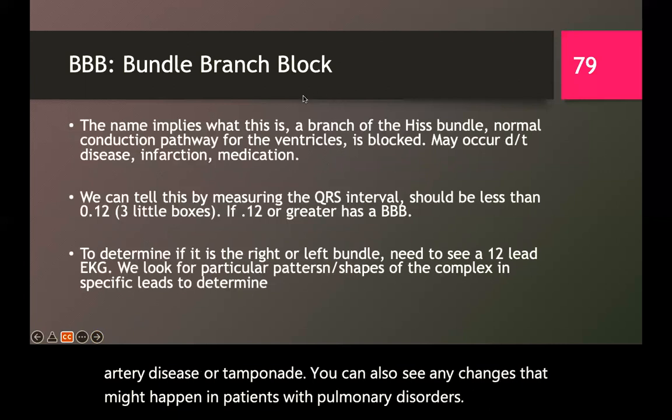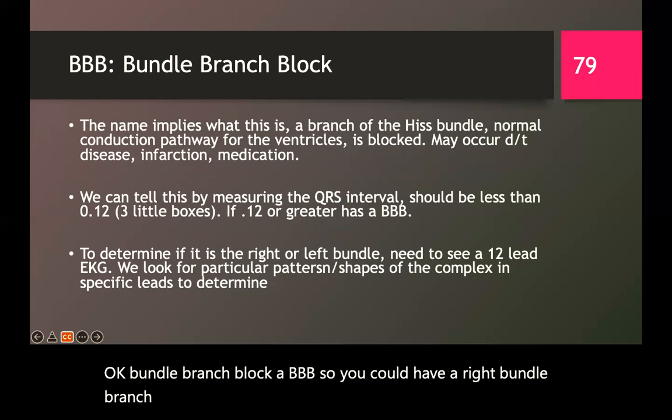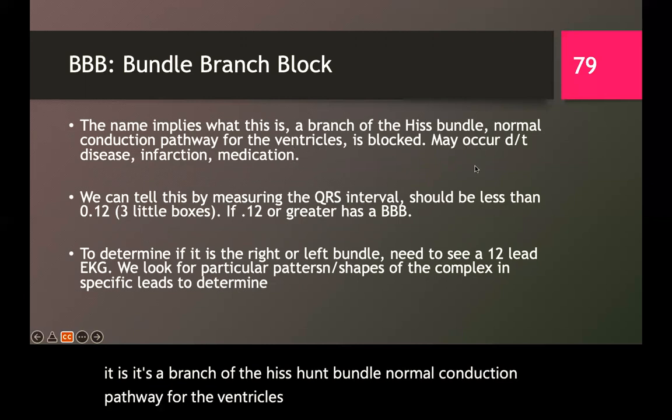Okay, bundle branch block, a BBB. You could have a right bundle branch block or a left bundle branch block. The name implies what it is. It's a block in a branch of the His bundle. The normal conduction pathway for the ventricles is blocked. Many occur due to disease, infarction, and medication.